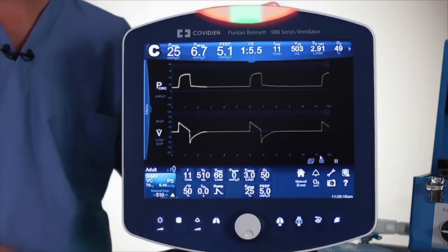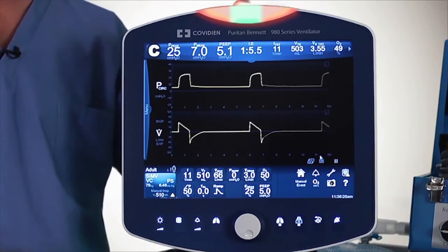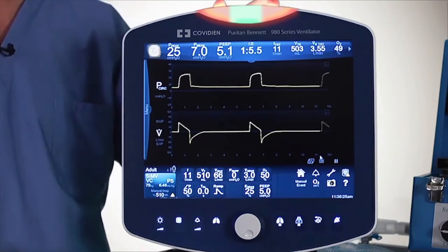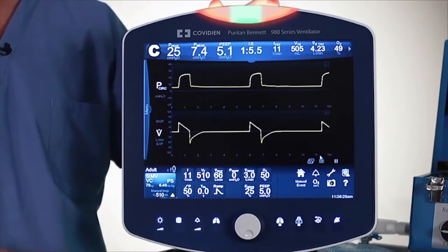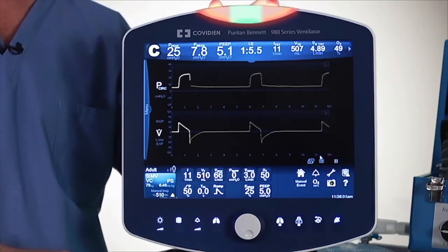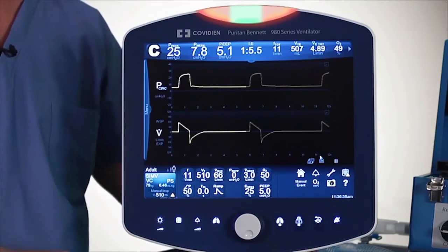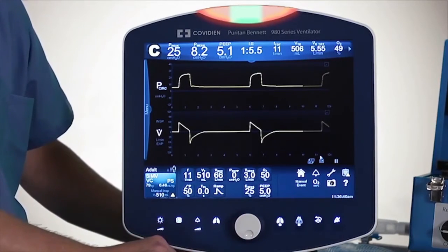Then you get an interesting appearance on the top of the actual display. So this green area means that the condition currently is perfectly fine, but we want to let you know that an alarm did go off, and that maybe you want to check and see what that is under the actual alarm log. And so that'll be the next place I'll go, to the alarm log, to check and see what was that alarm that went off.